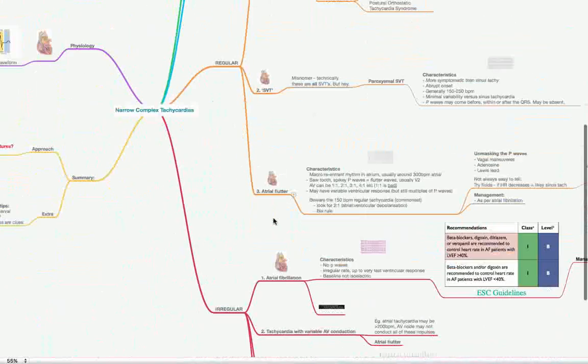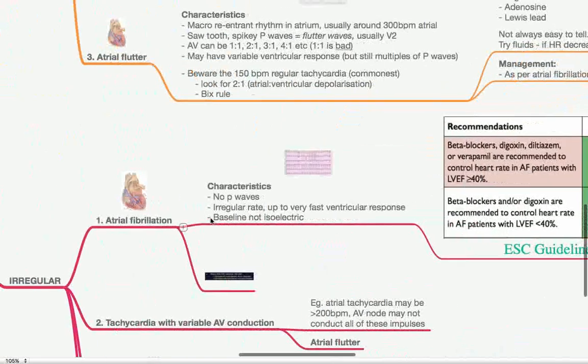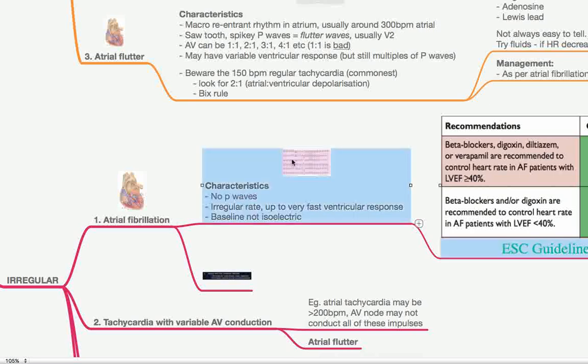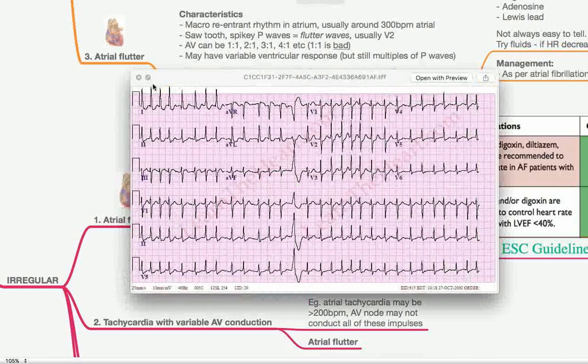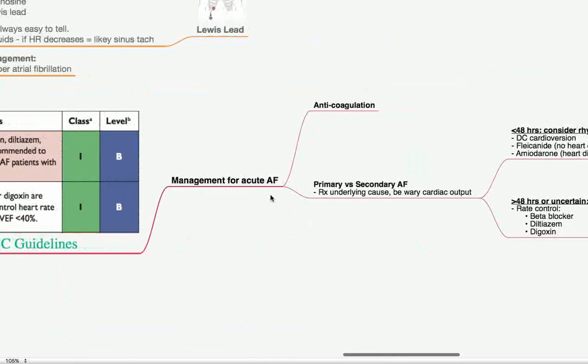So we've covered our regular narrow complex tachycardias. Let's move on to our irregular narrow complex tachycardias. AF is a very familiar friend for all of us. No P waves because the atria are just firing off at such an irregular chaotic rate. The rate is also very irregular because of that chaotic nature. And the ventricular response can be extremely variable. If someone's got high sympathetic tone, if they've got thyrotoxicosis, it could be very fast ventricular rates. If they've got beta blockers on board or parasympathetic tone is increased, then it could be a lower ventricular rate. And this is a fast AF. And you can see, we don't really have any P waves. It's irregular. It's narrow complex. Hey-ho, it is atrial fibrillation.